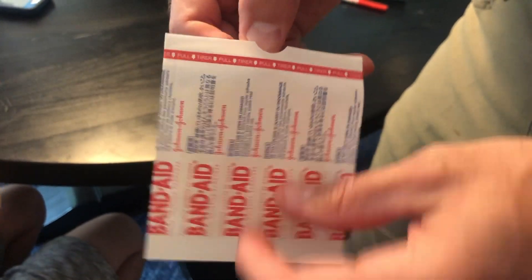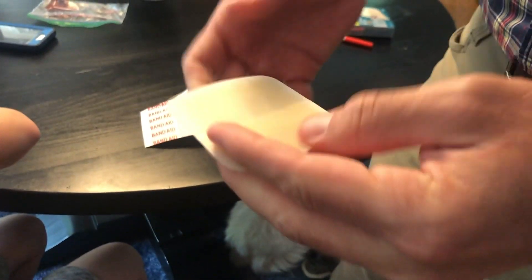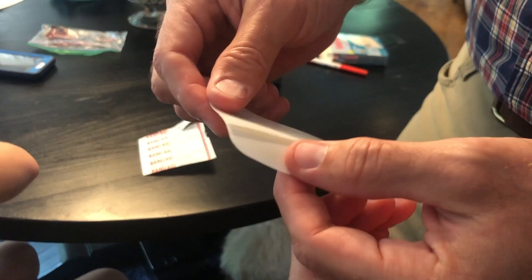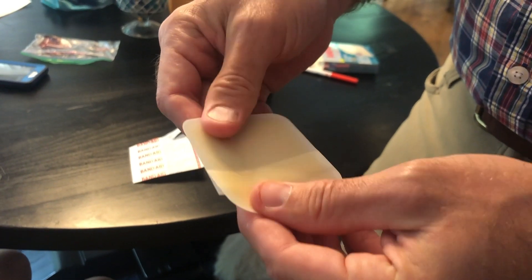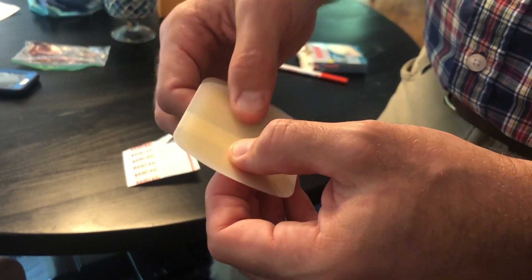To open the bandage, you just peel apart this area here and you'll see this is the hydrocolloid bandage itself. It's kind of a thick, rubbery feel, but it adds a nice pad to the skin where you're going to place it.